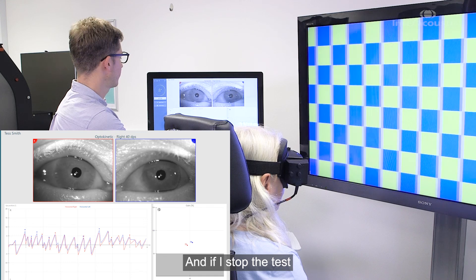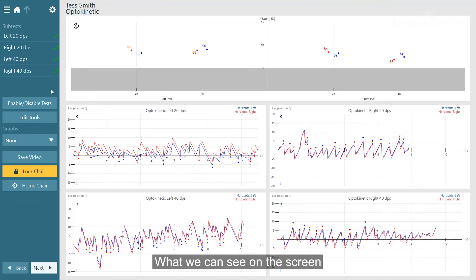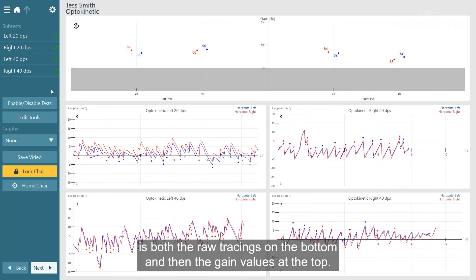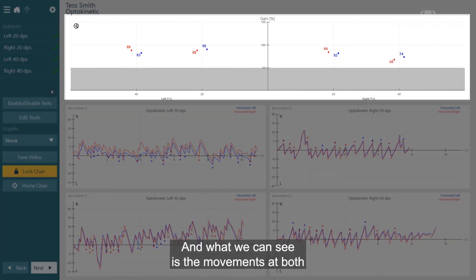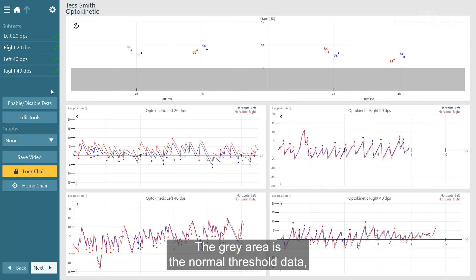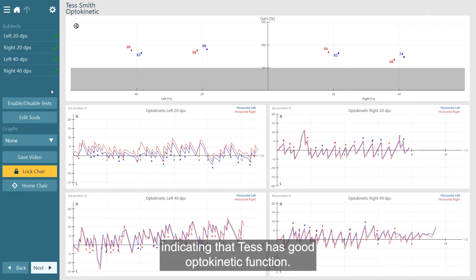If I stop the test here, we have sufficient data. On the screen we can see both the raw tracings on the bottom and the gain values at the top, showing movements at both 40 degrees and 20 degrees per second for the left and right. The gray area is the normal threshold data, and Tess's responses are well above that line, indicating good optokinetic function.